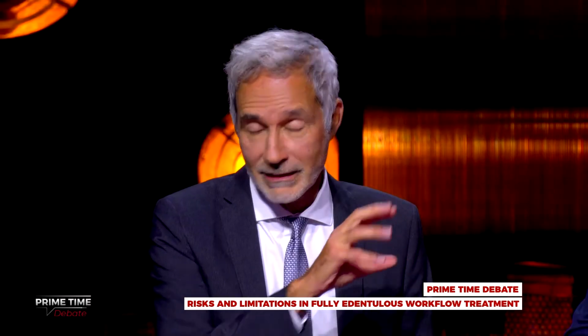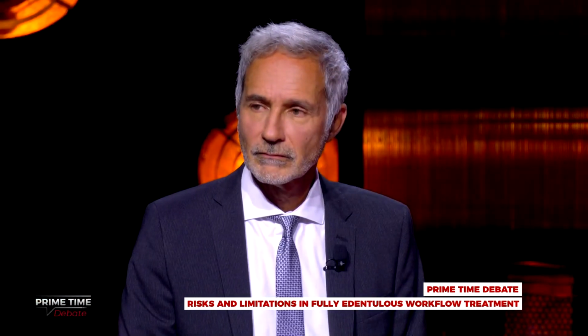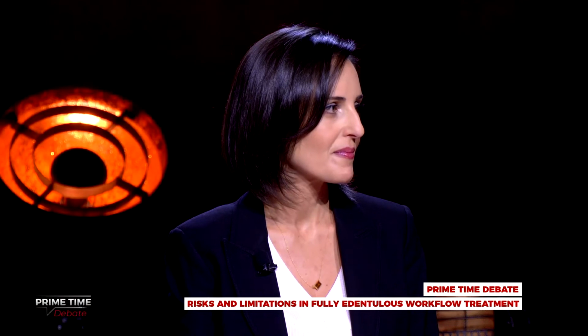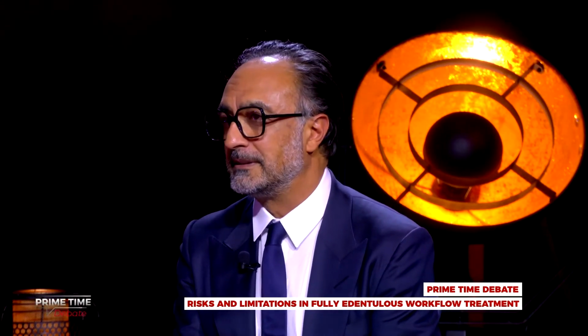You mean, Ali, when you have an edentulous case? Edentulous cases, yes. In this case, we have some teeth that give you the position. Agree. And you can help. Completely agree. I'm talking about the fact that the topic is fully edentulous, so I'm just giving the message that it is impossible. And I think we had a discussion early in the morning. There are also studies and literature supporting that using the pins is not really helping us at all, to see whether Sergio got the implants in the correct position or not.